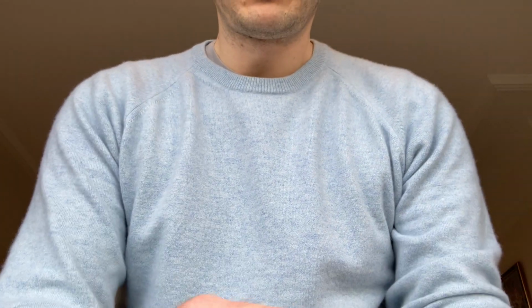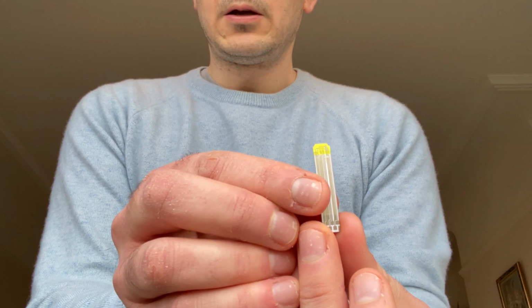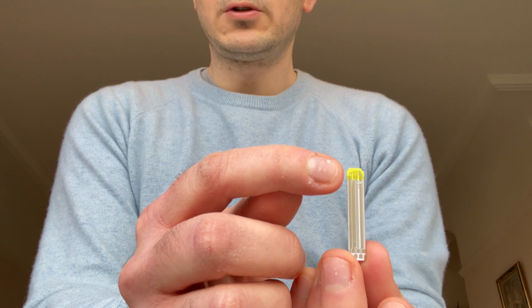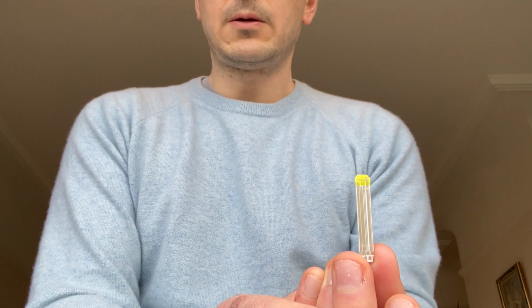Before that, let me just show you what one of these test strips looks like. Let me swap the video. Oh, I cannot do that, so I can just show you here. I've taken the plastic off, and you can see the yellow bit, and possibly some electrodes in there. There are all the 3 electrodes needed for the electrochemical measurement.